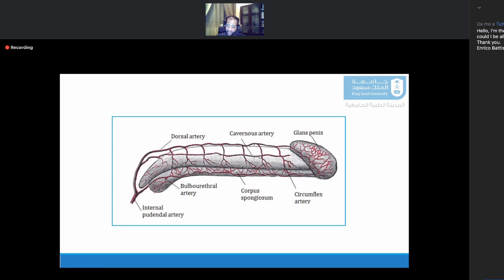So patients who have had previous urethral surgery, either hypospadias repair or urethroplasty, avoid at any cost implanting them through the subcoronal approach. Patients with vasculopathy who have had lower limb ischemia before, avoid this approach. Patients with poorly controlled diabetes also avoid this approach. And I have to say, in all the case series published by Wilson in 2007, those people were not diabetic. They were only implanted through the subcoronal approach.